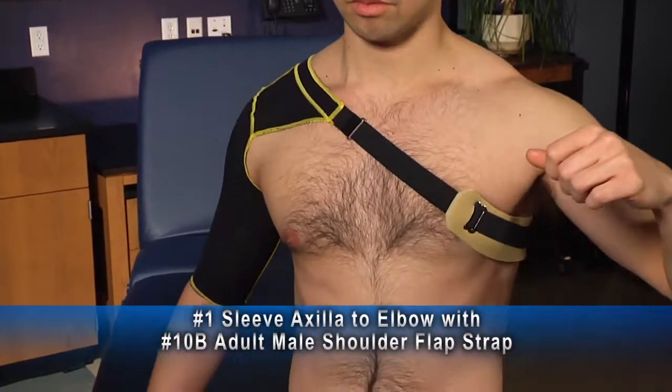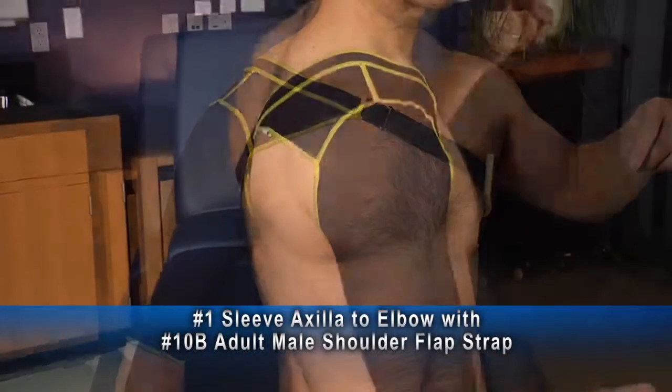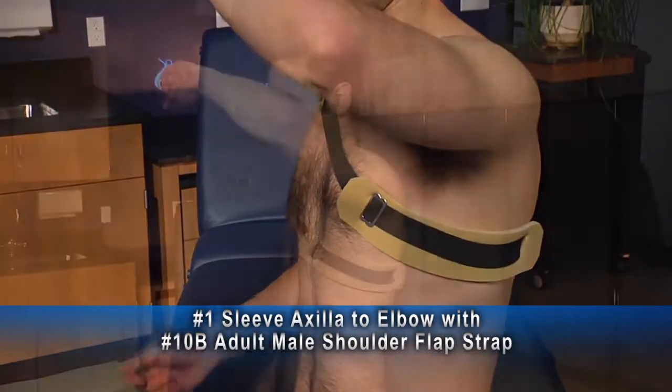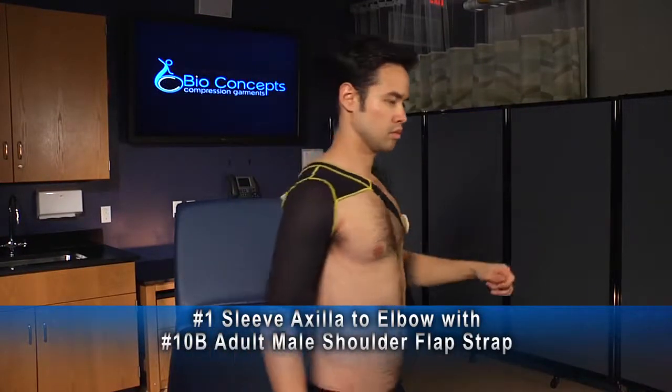This number one sleeve axilla to elbow with number 10B shoulder flap strap for an adult male has an adjustable strap around the torso, and the foam piece protects the skin from the strap itself. It helps keep the sleeve in place.